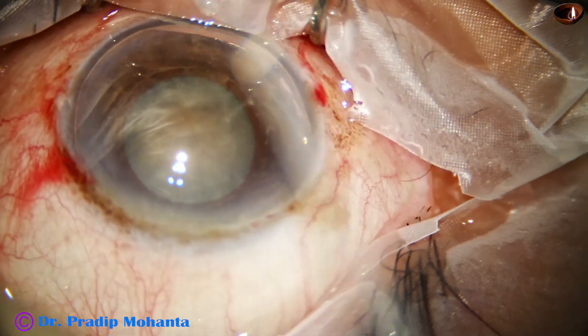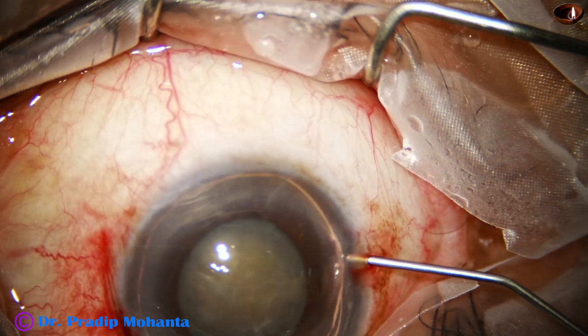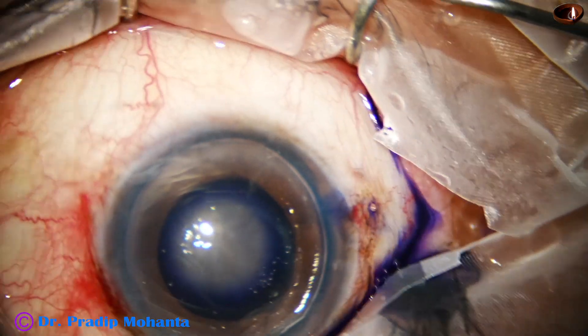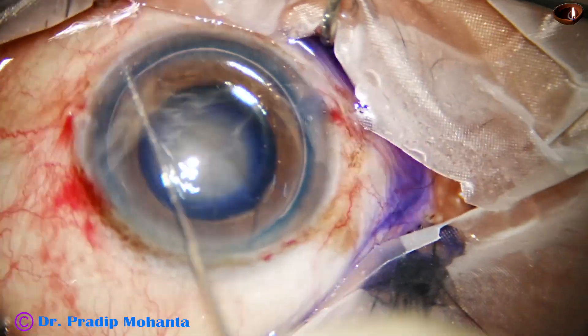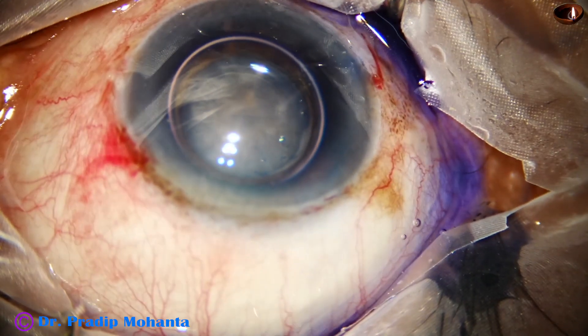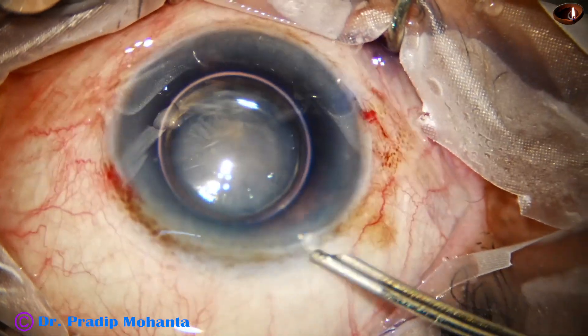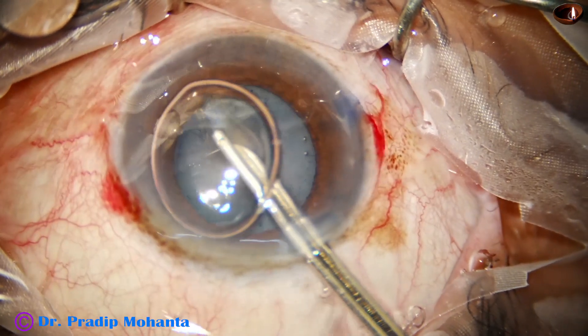We have got a single air bubble and now trypan blue dye is applied over the anterior capsule. If we apply the trypan blue dye underneath an air bubble, staining is very fast, very quick. We don't have to wait for one minute — we just continue the next step and the staining is done.